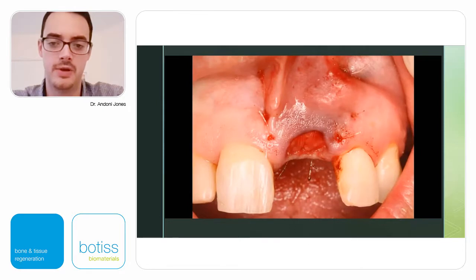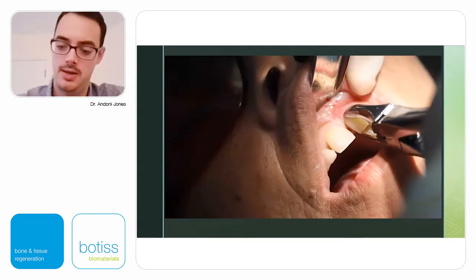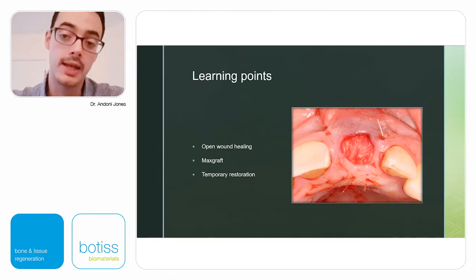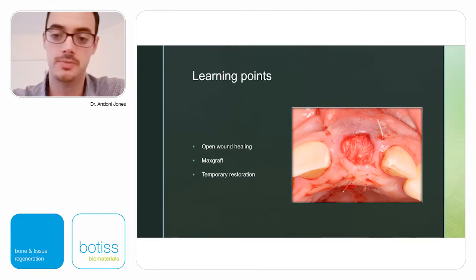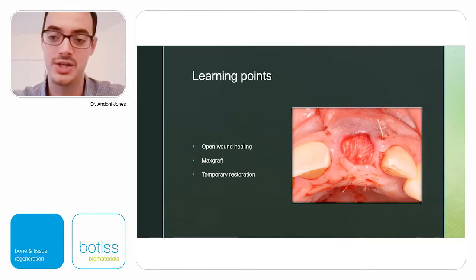No papillae were reflected and no flap was raised — we leave it to heal by secondary intention. The pericardial membrane at the socket entrance will dissolve relatively quickly, and new tissue will grow onto it. In two to three weeks the socket entrance will start closing. That area — about seven or eight millimeters in circumference — will be covered by newly formed tissue, adding additional tissue for restoration and emergence profile. The bulk of bone is visible beneath the gum, filling the area very well.